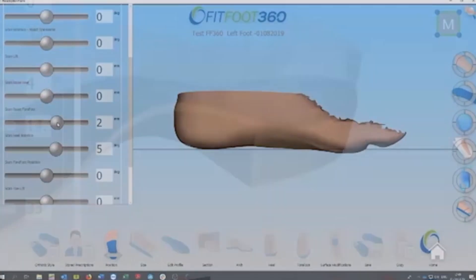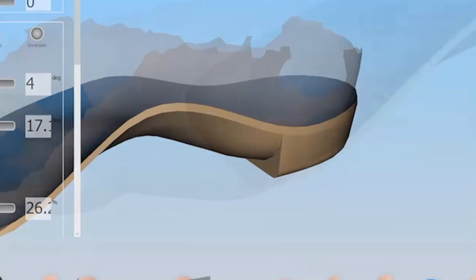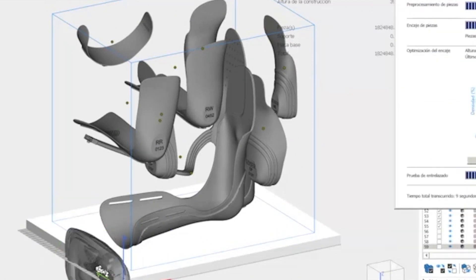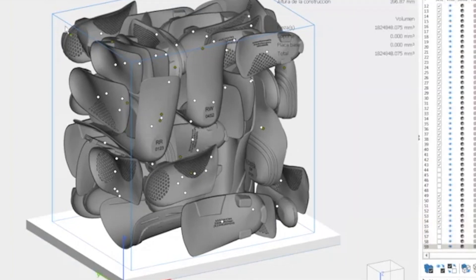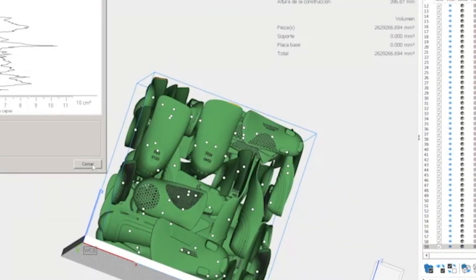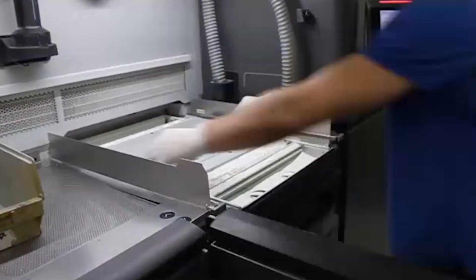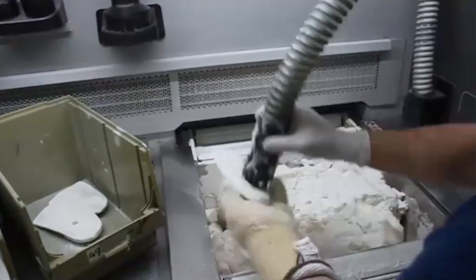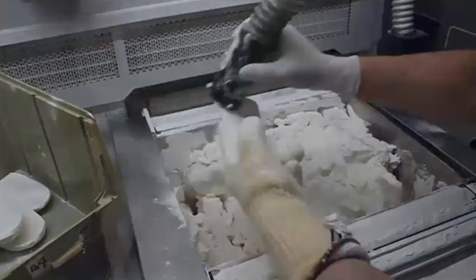Once there, they adapt your scan based on this information, designing your new orthotics to match. This then gets sent to the 3D printer in a batch along with many other orthotic devices. After printing, any excess material is recycled back into the machine for reuse, before the devices are cleaned and finished by the lab technicians.